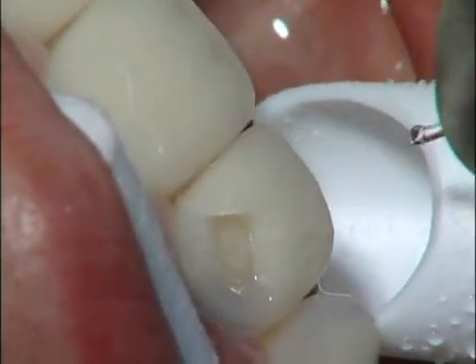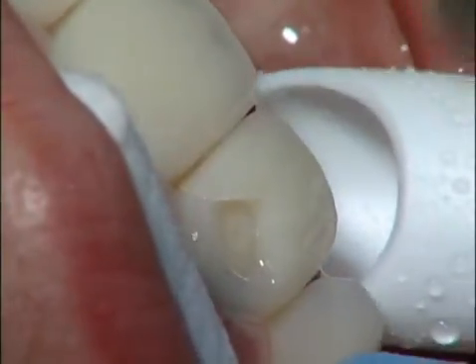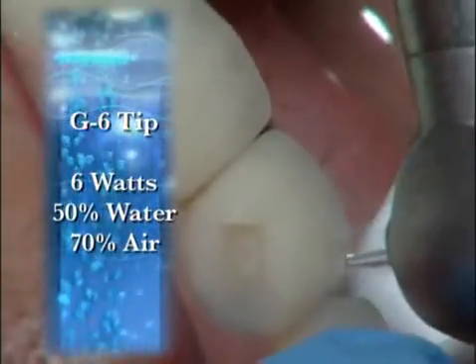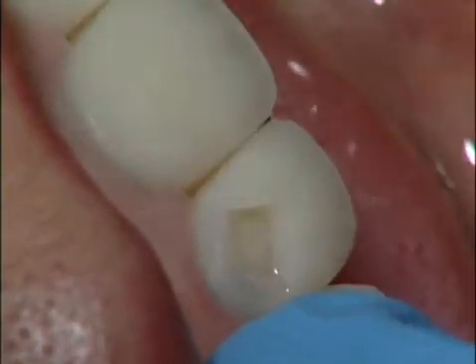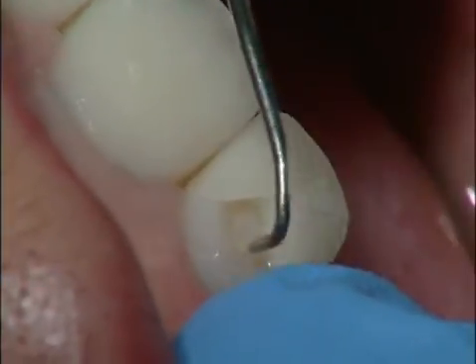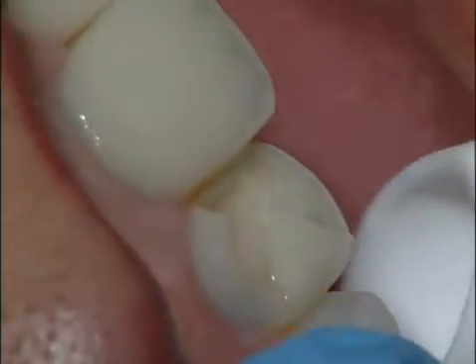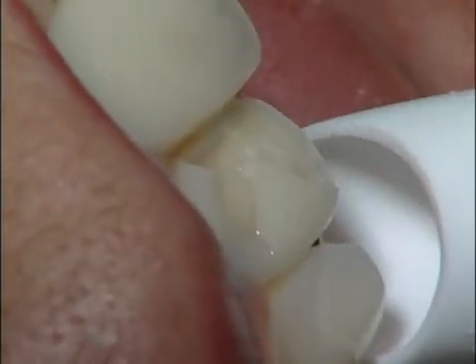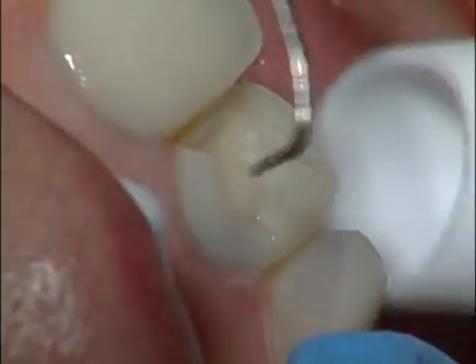So come at the buccal surface of the porcelain veneer with a G6 tip, 6 watts, 50% water, and 70% air. You'll need to be 2 to 3 millimeters away from the surface. You'll notice the cracking of the veneer, and the pieces just pop right off. There's no damage to the sapphire tip. And in most cases, no discomfort to the patient.